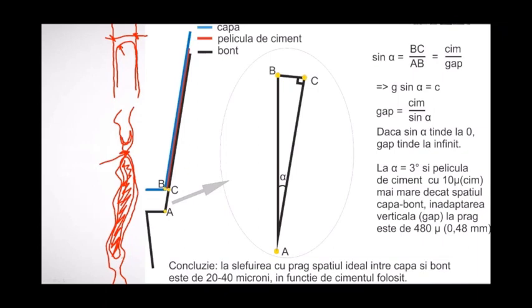In some places you see the cement has enough space to go. In other places, where you have the red arrow, there's no space for the cement, no space at all. What do you have there? Air, nothing. Just a highway for microbes. There you have the cement, but here is what? Just air.